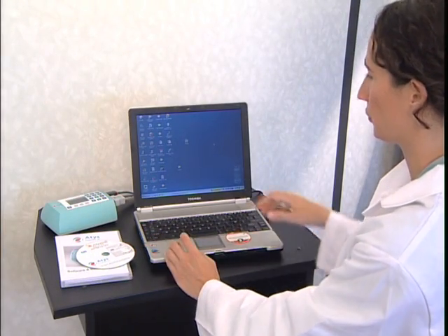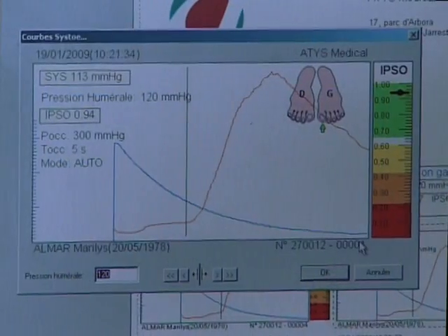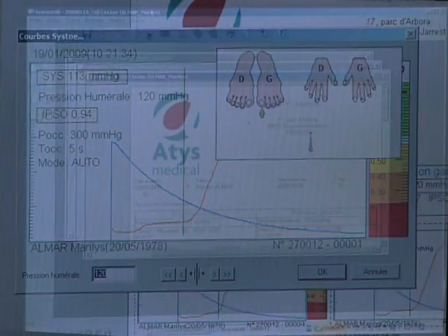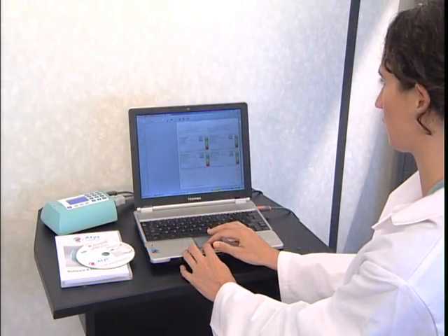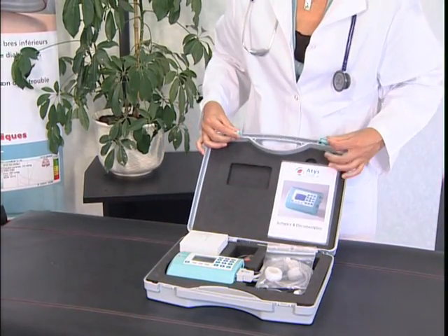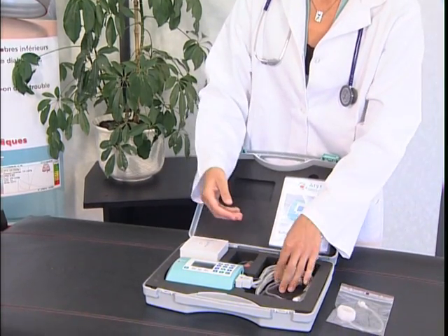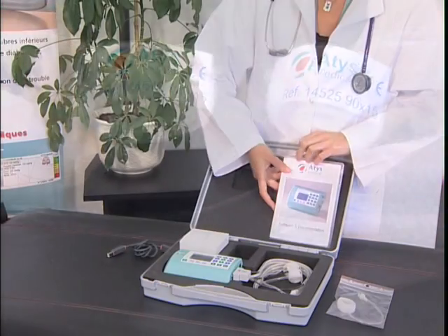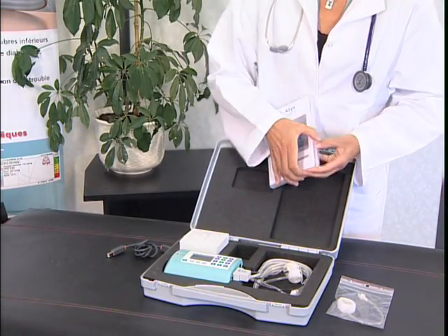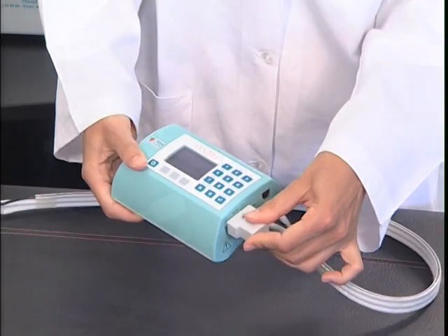Results stored in the Cysto can be transferred to a PC for backup and printing. The Cysto's case contains the photoplethysmography sensor with its cuff, two occlusion cuffs of different lengths, a charger and special PC software. The Cysto's connection system is simple and mistake-proof to prevent misconnection.